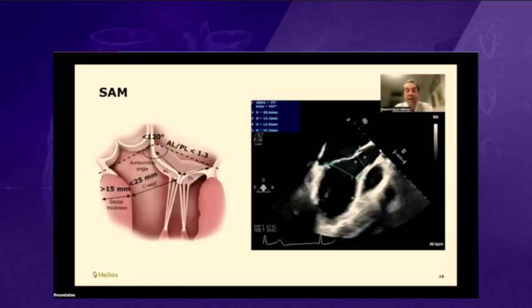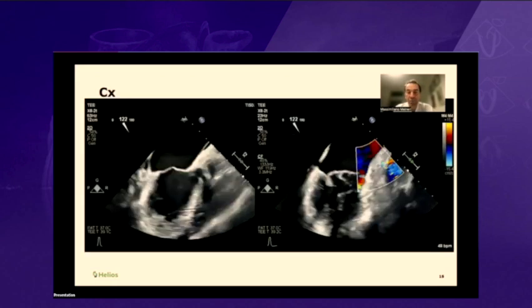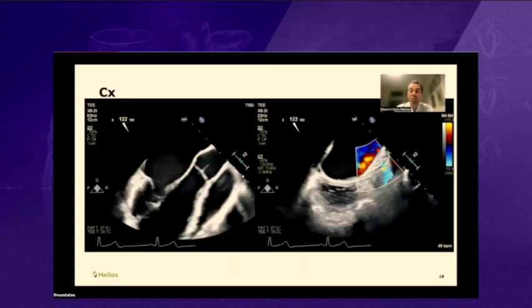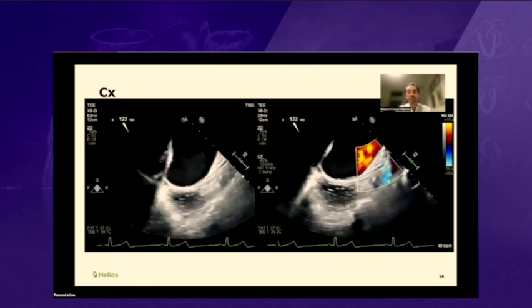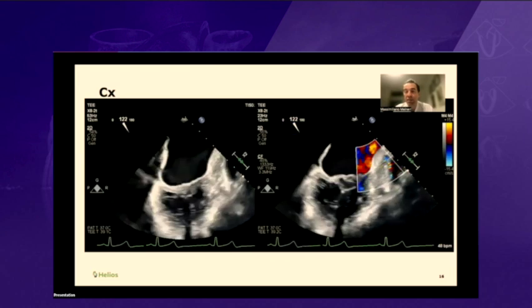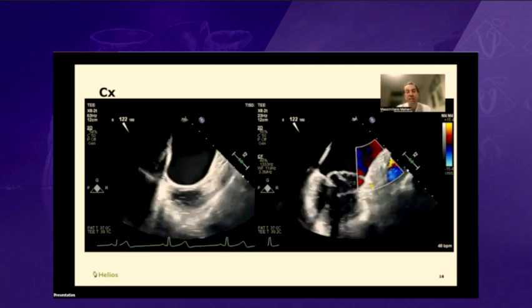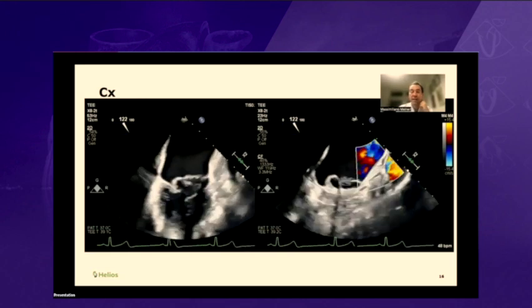Assessing the risk of SAM in this case, the only significant value is the angle between the mitral valve and the aortic valve, which is 107 degrees — less than 120, as shown in the sketch from the previous talk. We also looked for the circumflex. Starting from the long axis, I turned to the left, followed the left main, saw the bifurcation, saw flow in the circumflex as it starts, but didn't see flow continuing as it goes along the annulus.